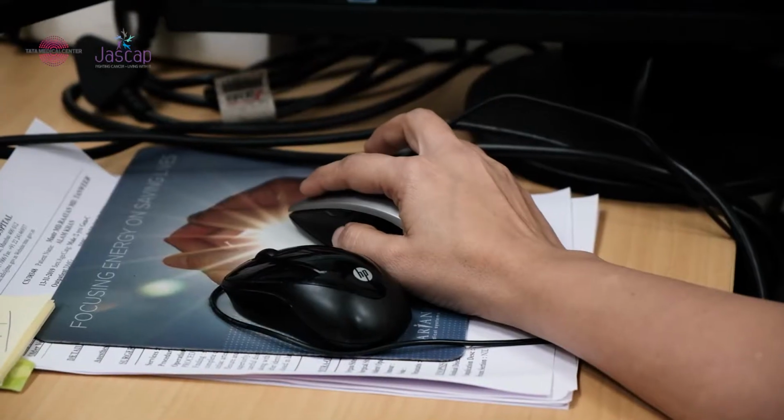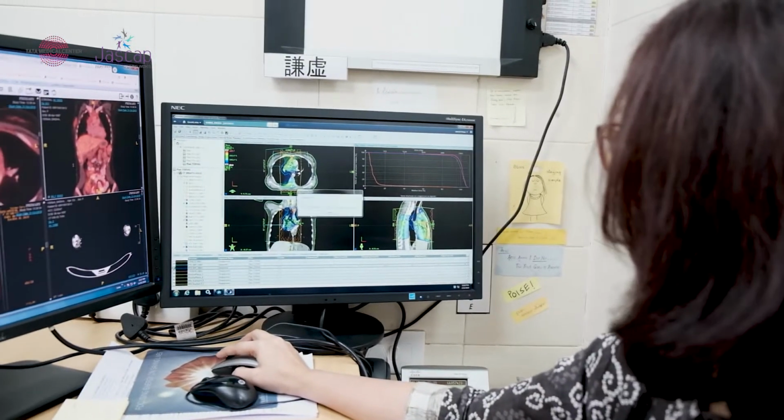Often staff will give you a set of instructions before the actual procedure. And like I said, depending upon the site that we would intend to treat, you will get crisp instructions from your treating team. Once you are positioned with your immobilization devices, there could be a need to inject contrast. Again, we would be eliciting whether you have previous allergy to these contrasts. If so, we will not use contrast. If not, in most situations, we will be using contrast to see where exactly we wish to focus radiation therapy beams to cure your lymphoma.